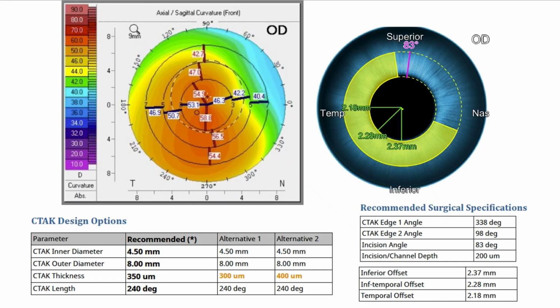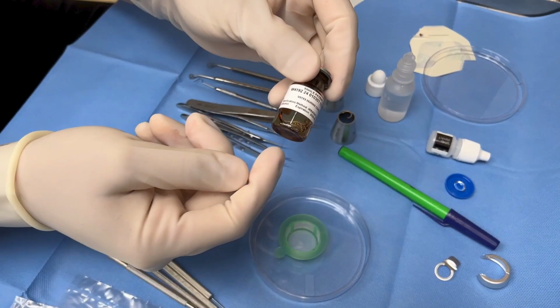And then we get to the day of surgery. So let's go through that surgery now. So this is how the tissue is going to come to you. This is, first of all, gamma-irradiated tissue. So this is acellular, right?